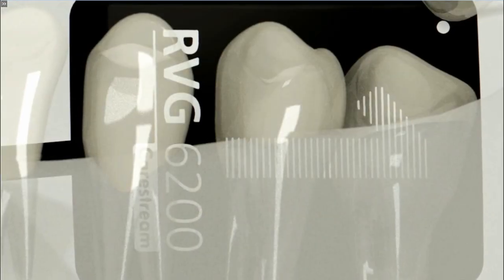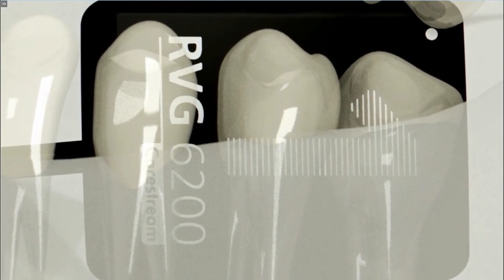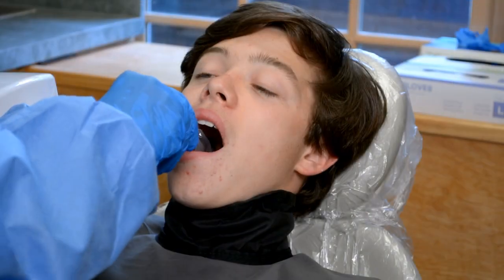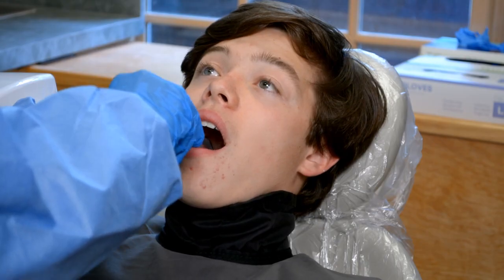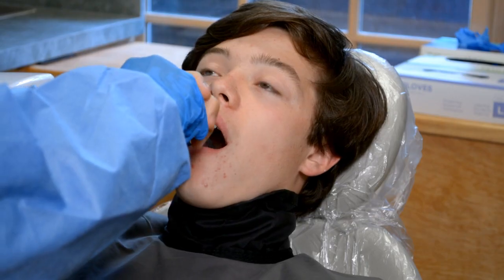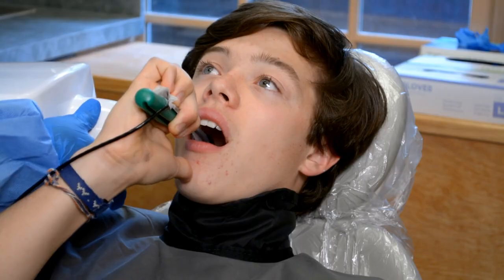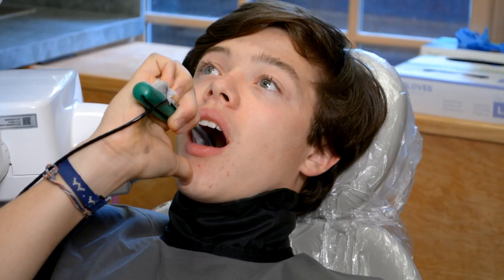Place the sensor as far posterior as needed in a sweeping motion. Position the sensor between the tongue and the teeth, using the rigidity of the sensor to push the tongue out of the way. Place the sensor as close to the patient's midline as possible. Position the sensor parallel to the long axis of the teeth and verify the horizontal placement. Ask the patient to close their mouth, gently align the generator tube with the positioning device, and move into position to acquire the image.